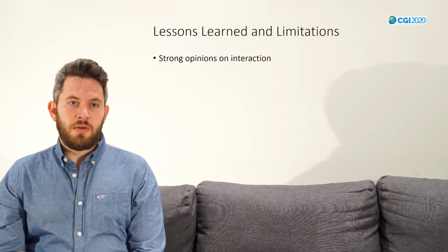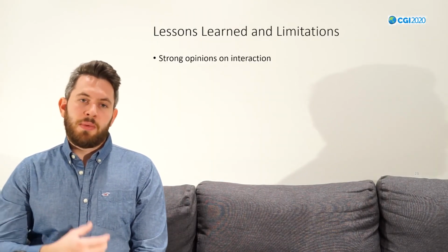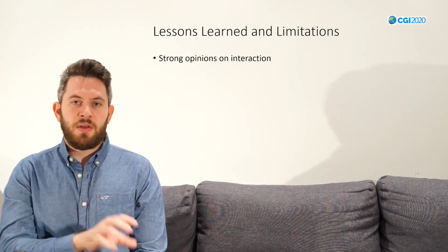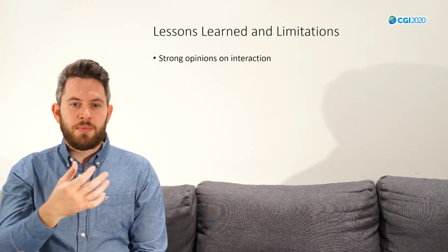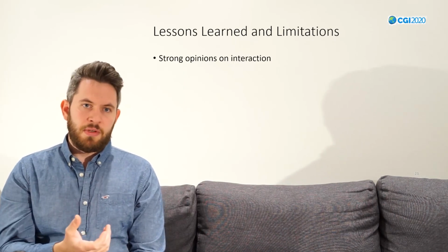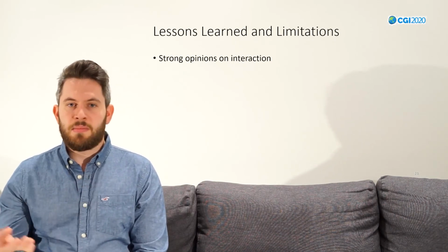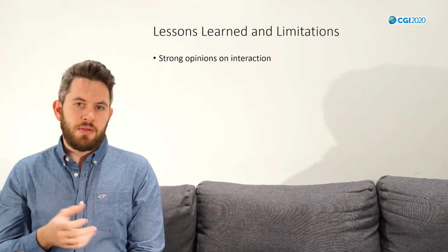So now to our lessons learned and some limitations of our applications. So we have seen, for example, that there are strong opinions on interaction methods. So we had a look at radiology setups and how they interact with the setup, and we tried to give the radiologists the interactions that they're used to, but during the evaluation we have seen that this is not standardized. So some radiology experts use different tools than others, and for example the slicing could be by scrolling but also with a slider, so this is not standardized.